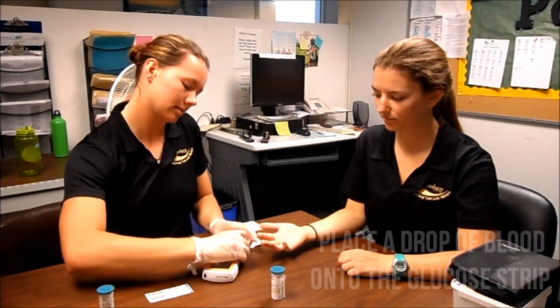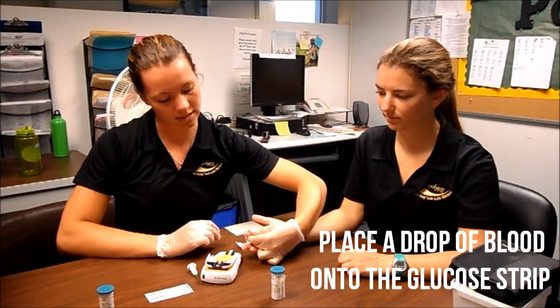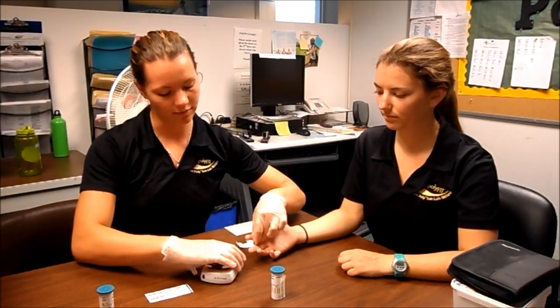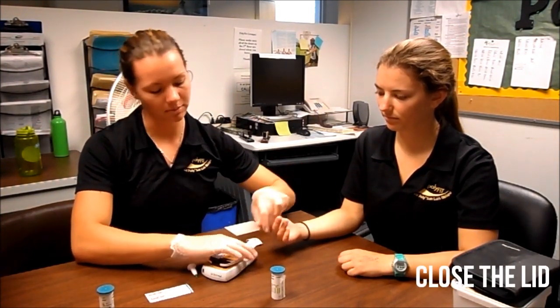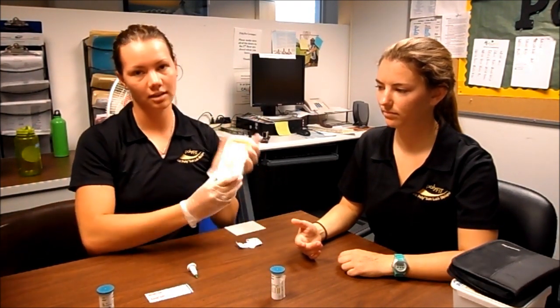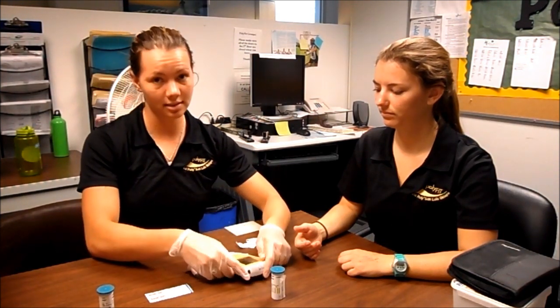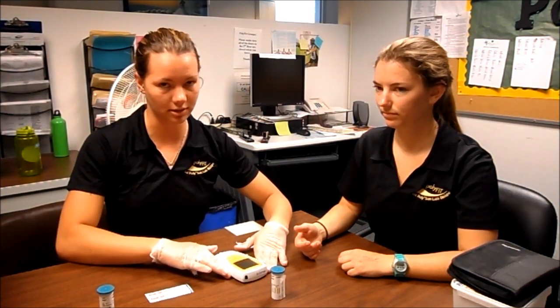Open the machine and milk the finger so you get a nice amount of blood to fill the pad. Put the blood on the pad, close the machine, and it'll start counting down for your glucose reading. This test only takes about 12 seconds, so we do it first.